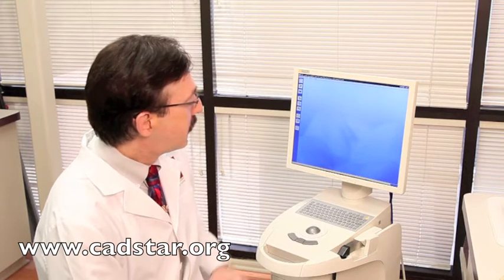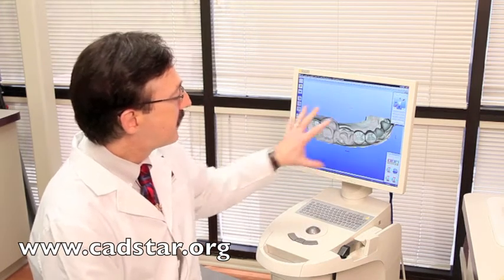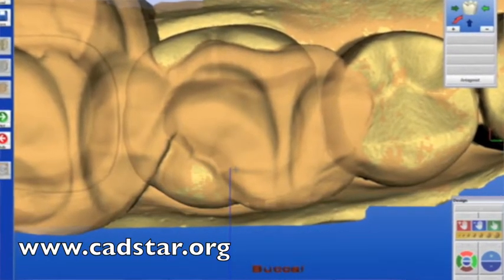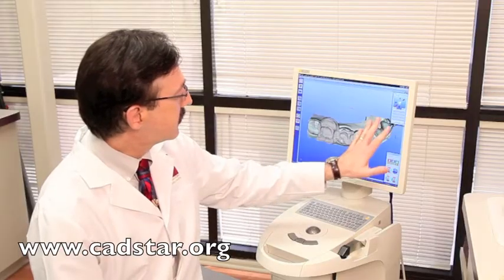When the screen goes blank it's a good thing, because that means it's stitched everything properly. You'll see both of our virtual impressions on the screen: the yellow is the preparation virtual die, and the tan is the bite registration. You'll see that the untouched tooth surfaces that are overlaid have this speckled look — that means the stitching is excellent.